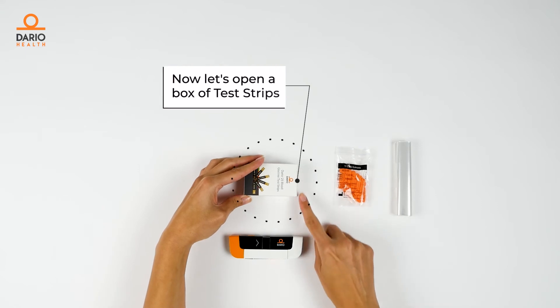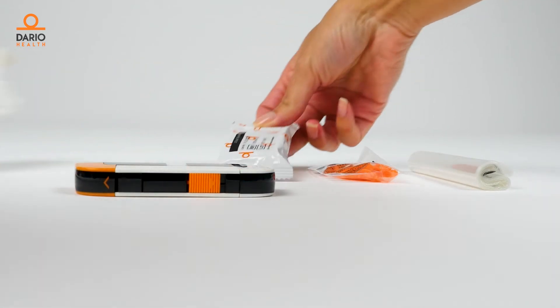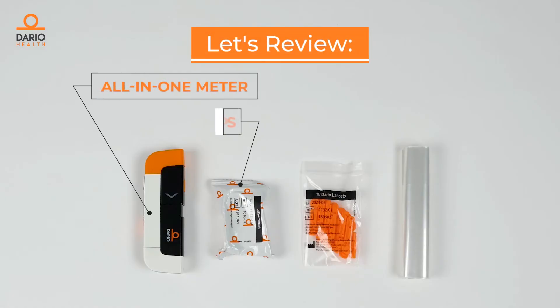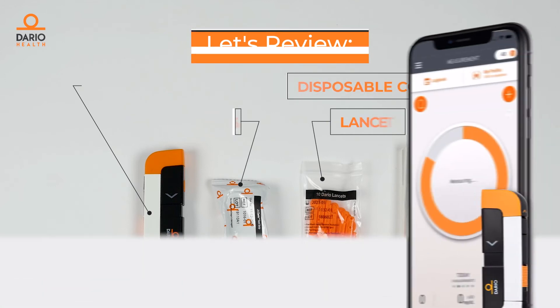Now let's open the box of test strips and remove the foil packet. Now you have your Dario smart meter, test strips, lancets, and disposable covers, and you're ready to go. And don't forget to download the Dario app.